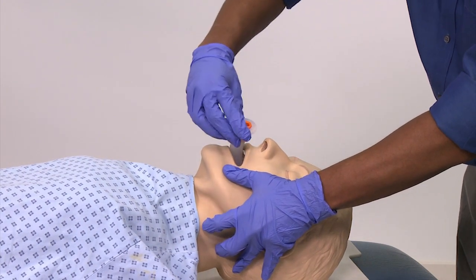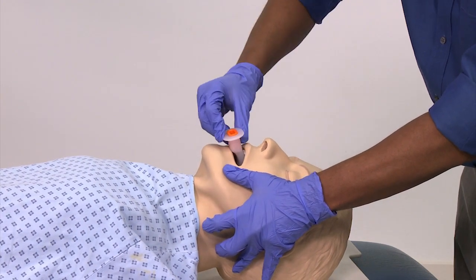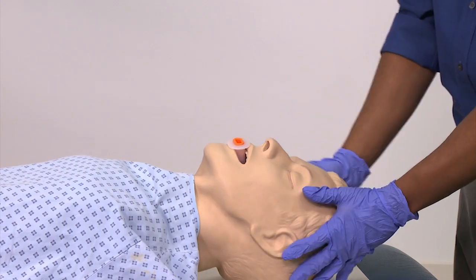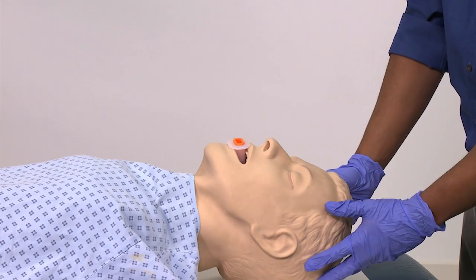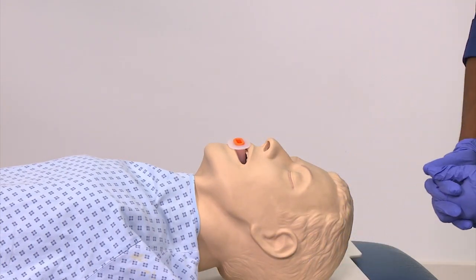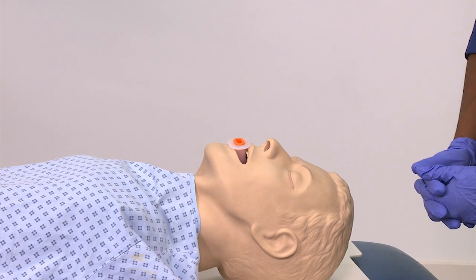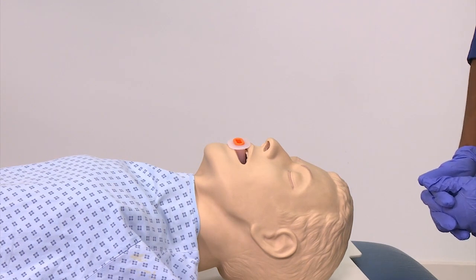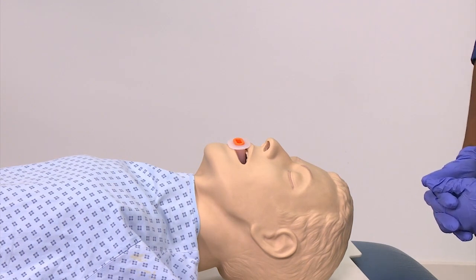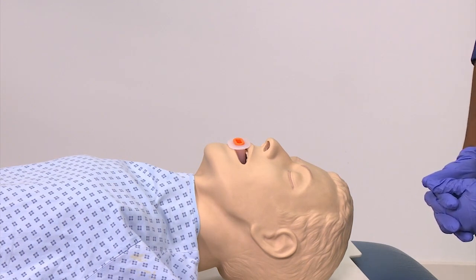Once in situ, the Guedel should remain there of its own accord. Do not secure it with tape, in case the patient starts to gag or cough, in which case they may aspirate because they cannot expel the device.